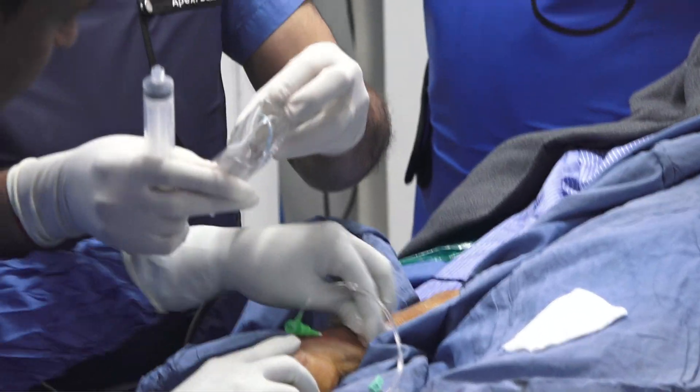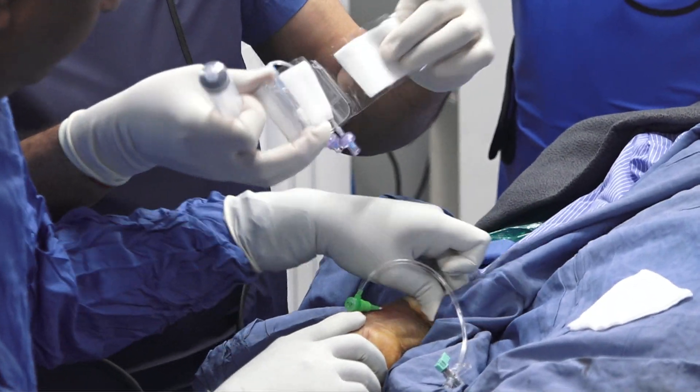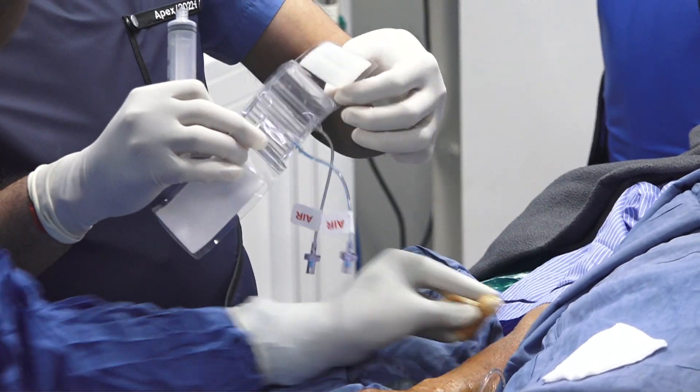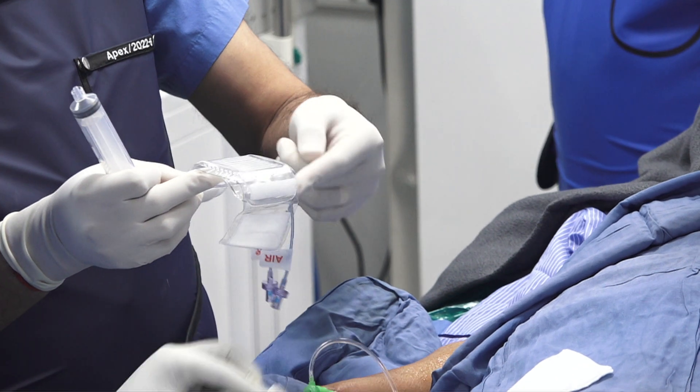I'm going to show you the device first. It's very simple and very effective. This is a two-balloon band with an arch on it.